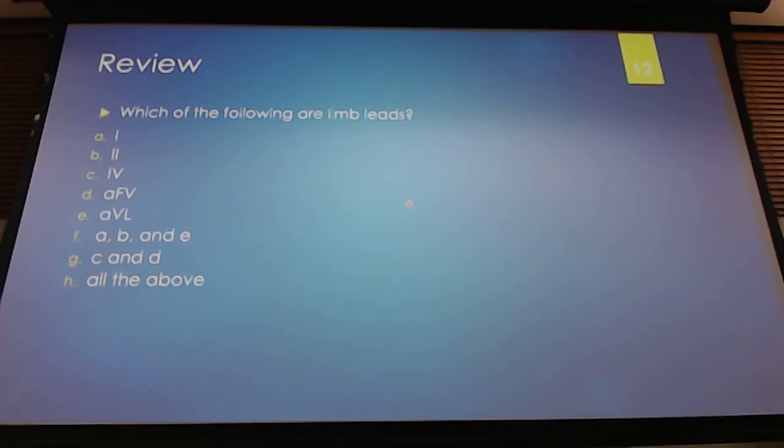Okay, ma'am. Which of the following are limb leads? Alpha, Bravo, Echo. Okay, because lead 1, lead 2, and then AVL. AFV? Is that America's Funniest Home Video? Yeah, that's not part. And then we don't have a lead 4, right? We have a V4, but we don't have a lead 4. And it's important to know the difference. Very good.